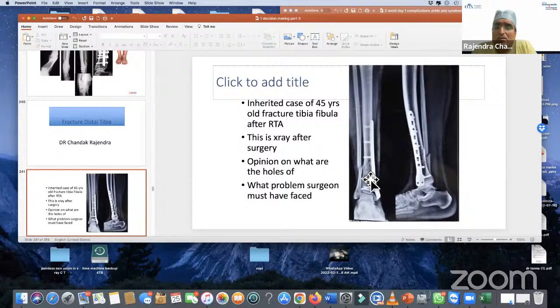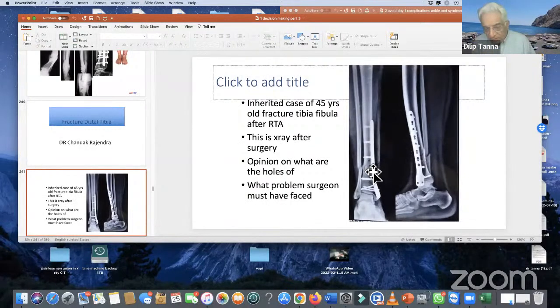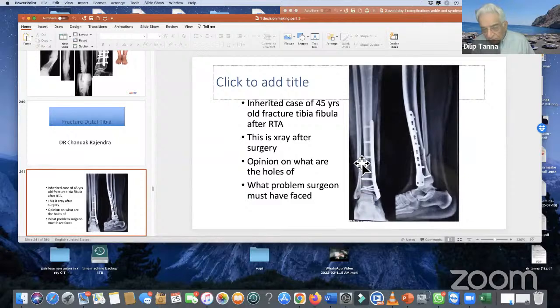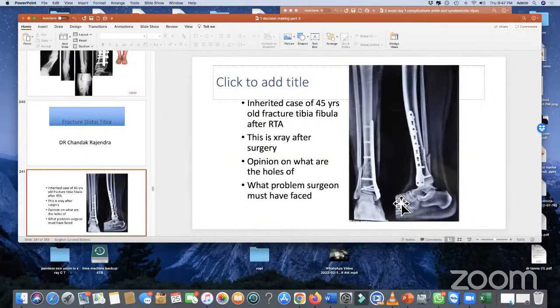Yes. Dr. Vasudev, yes. In a lower one-third tibia at this level, adding a fibular fixation gives you better stability to the whole construct. I perfectly agree, sir, with what I quoted from the literature. What you say is also right. This fibula being a transverse fracture, supposing you plate the fibula first, then the tibia will fall back into the normal anatomy, and then with the axial wire you can really correct it. But what you say here is perfectly right, that the plate has done the job of putting it into valgus. Even with the plate alone, if you had put this into the neutral position, you would have been able to correct this.